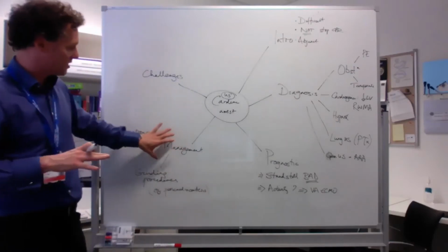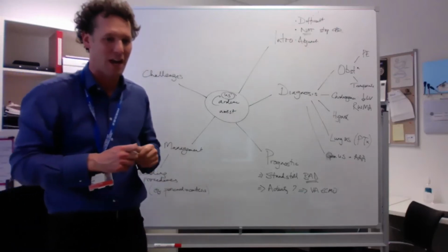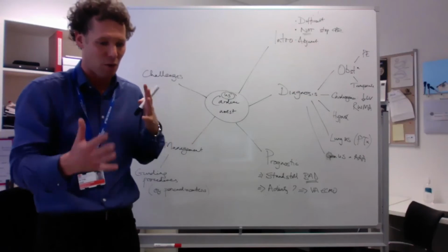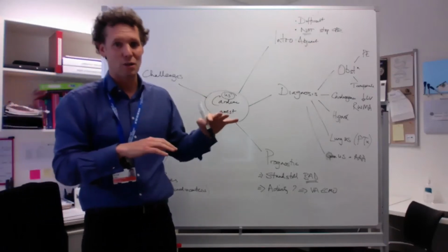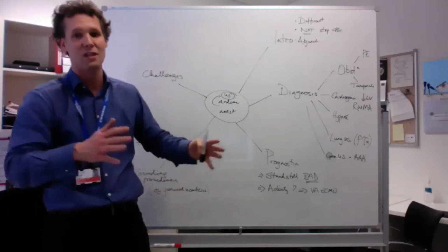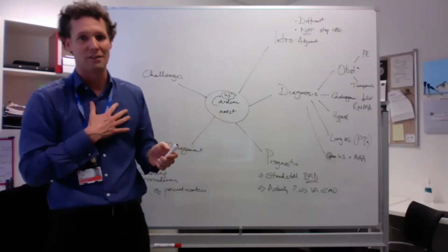It's another one of those things, like: discuss your use of echo in the management of a patient with ARDS. Describe how you would do it. If we're looking at the RV and we don't want to set the pressures on the ventilator too high, I'd say that if I change the PEEP or the tidal volumes, I'll go back and have a look at the echo. If I see the right ventricle dilating, I'll think about turning down the ventilator.